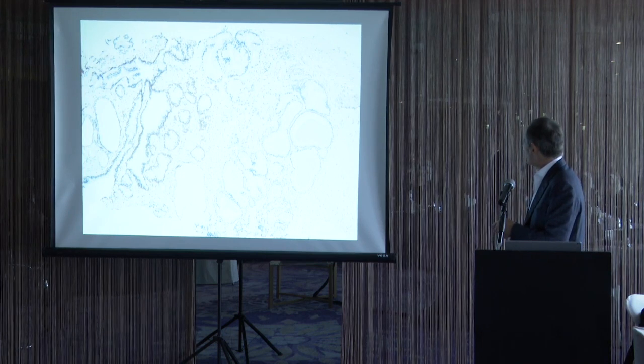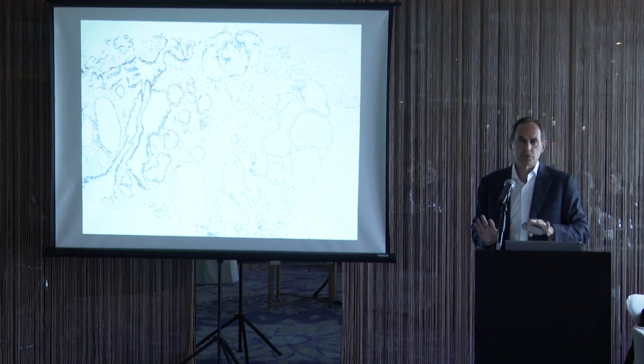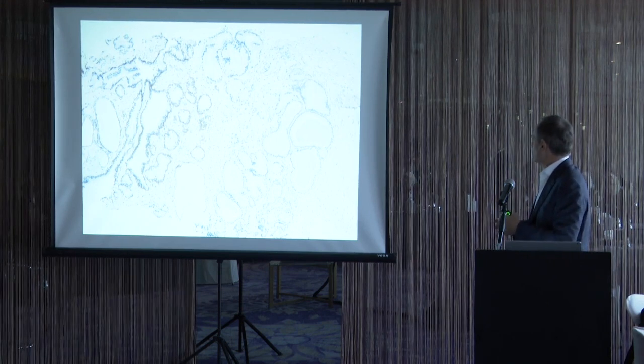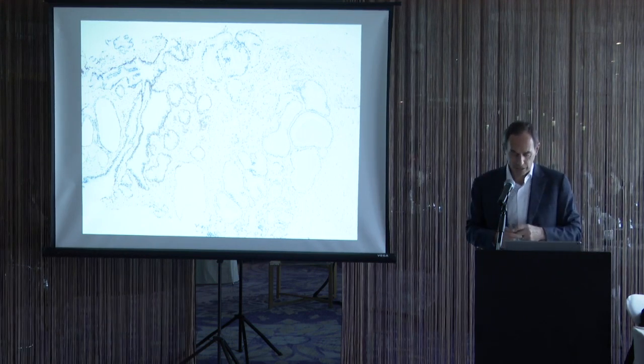Now, in this focus, if I started to see some patchy staining, a few cells positive, I would not call it cancer. I would call it atypical, suspicious for cancer. But the fact that all of these glands are entirely negative, and on the H&E, those areas were suspicious for pseudohyperplastic prostate cancer, you can make a definitive diagnosis.